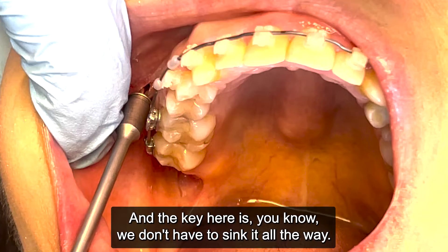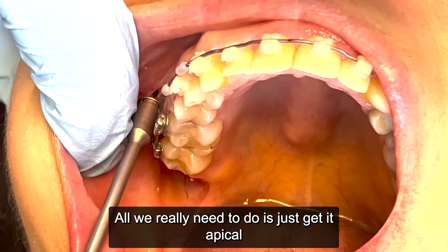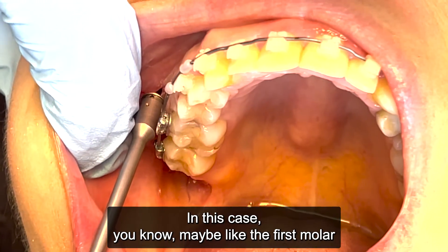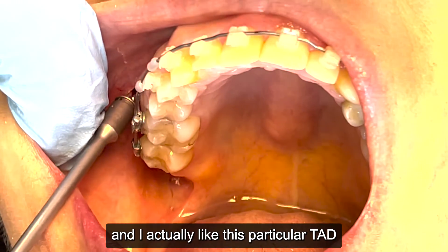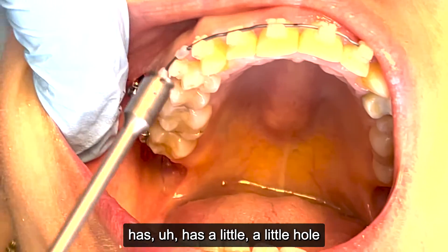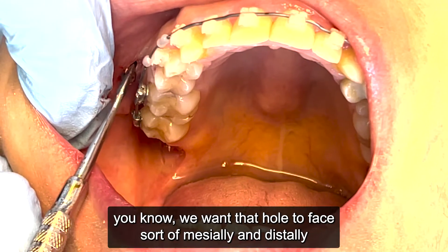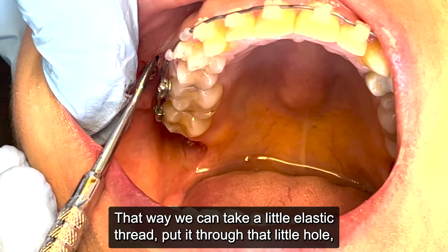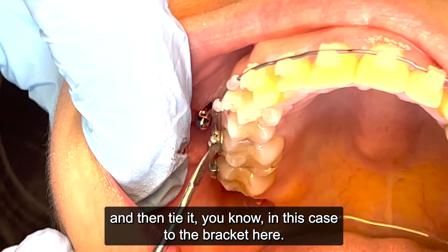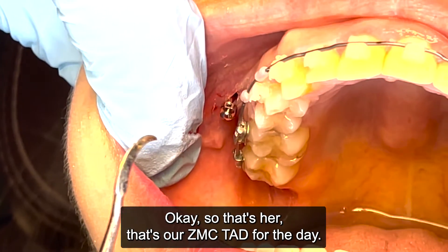The key here is we don't have to sink it all the way — we really just need to get it apical to whatever we're tying it to, in this case the first molar area. What I really like about this particular TAD is it has a little hole that we want oriented mesially and distally, so we can take a little elastic thread, put it through that hole, and tie it to the bracket. And that's our ZMC TAD for the day.